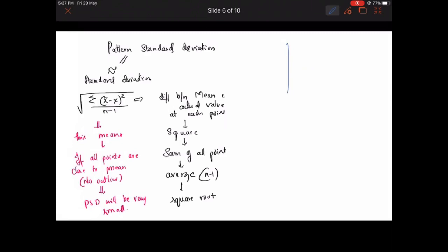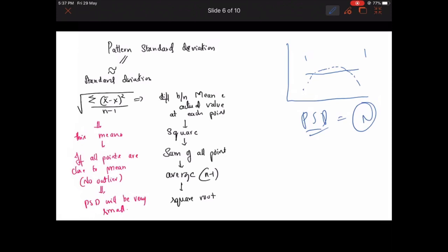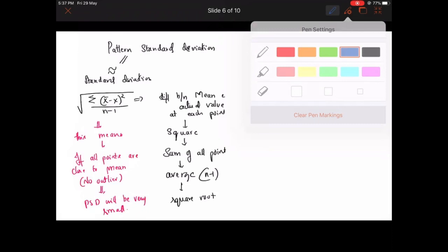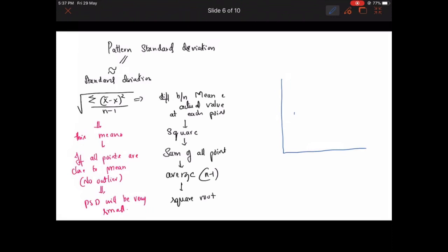If we look at a generalized depression case, even in the central 30 degrees, the pattern standard deviation will still be normal. Why? Because the mean and the actual values remain very close to each other even when all values are uniformly depressed. So pattern standard deviation will be normal in generalized depression. However, in a glaucomatous condition where there is a large localized defect, the mean may be close to most values, but at the region of the defect it is very far from the mean.